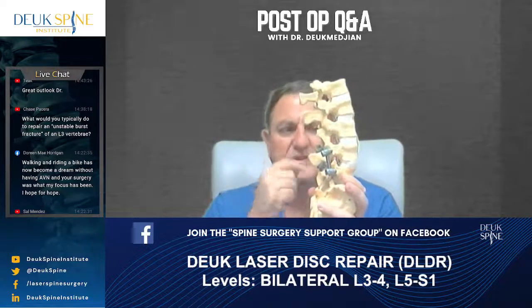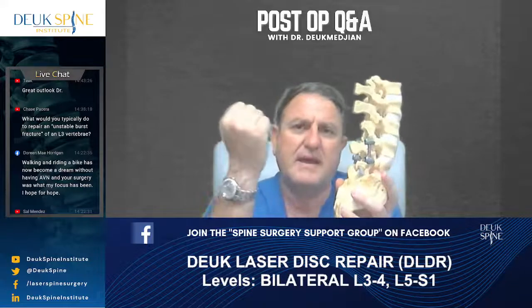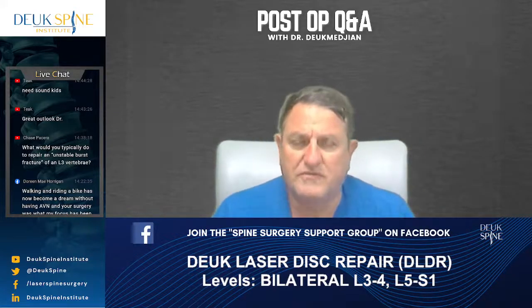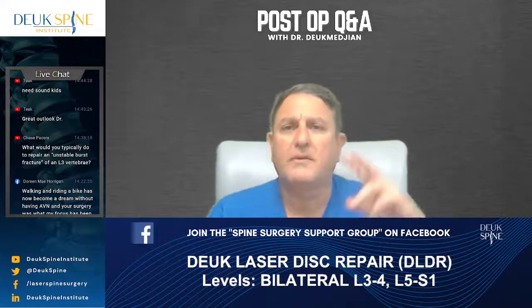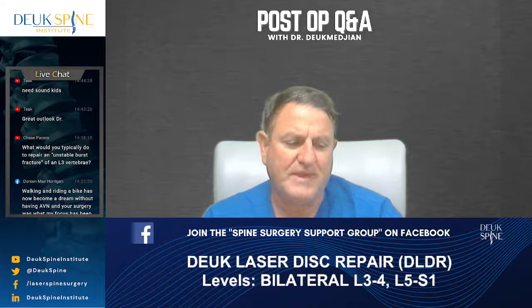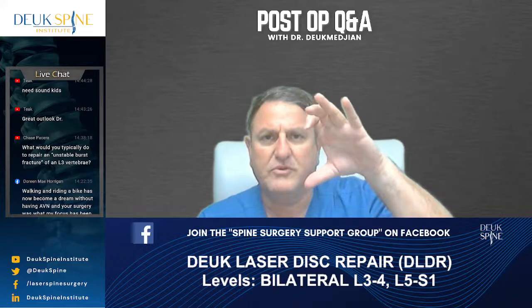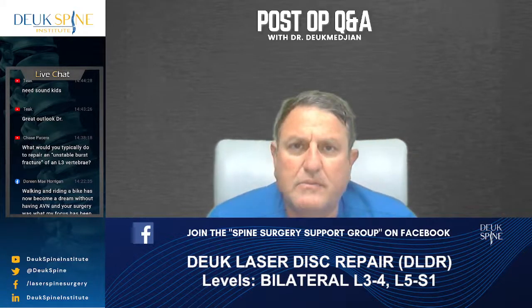I would decompress the nerves at L3 if they need to be decompressed with a laminectomy. And I would tap the bone fragments from the back forward and shove them back into the L3 body. So there's nothing pinching the nerves. If there's no neurological deficits, I would leave it alone and I would just do a fusion from L2 to L4. Now, when I say fusion, what I mean is I would put screws at L2, screws at L4, above and below the L3, and hope that the L3 will heal itself and fuse itself. And then you could even take the screws out a year or two later.